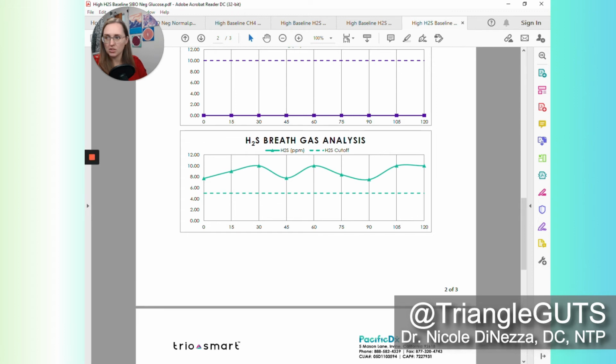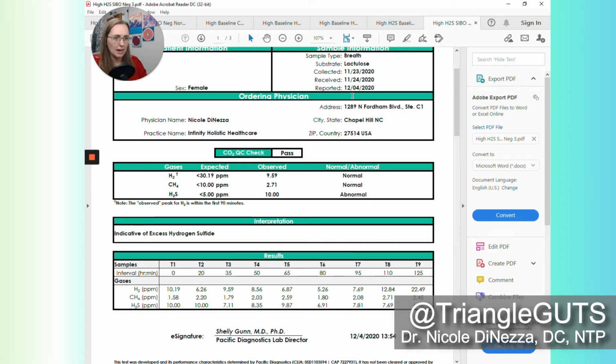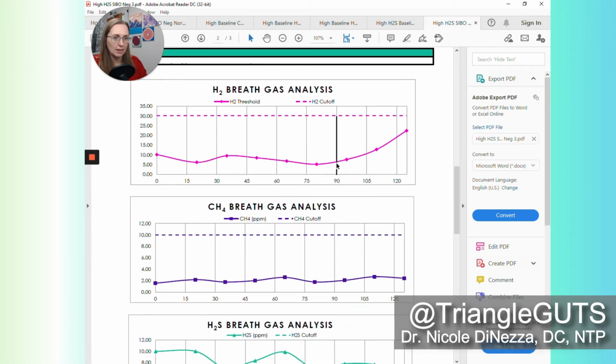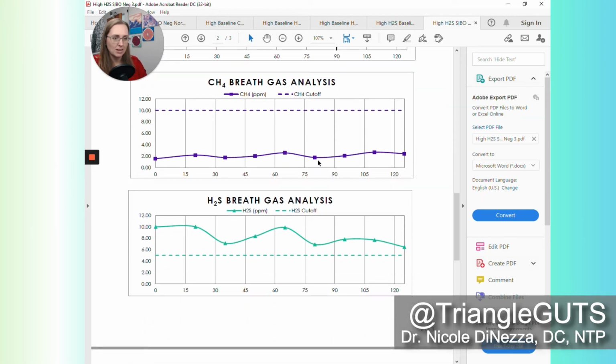So let's go ahead and check out yet another one. All right, quick glance. It's a lactulose test, and there are valid numbers for all of the results, so we can move on. Here we have another clearly negative hydrogen-based test up top. You can see that we don't get any sort of a peak until we get well into the colon territory here. Likewise, methane is nice and low.